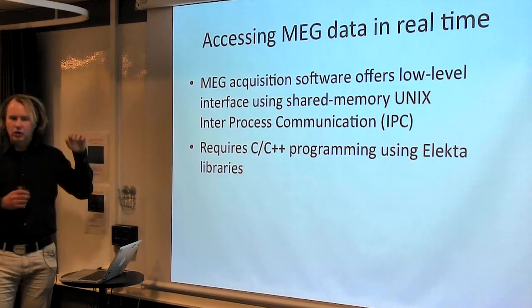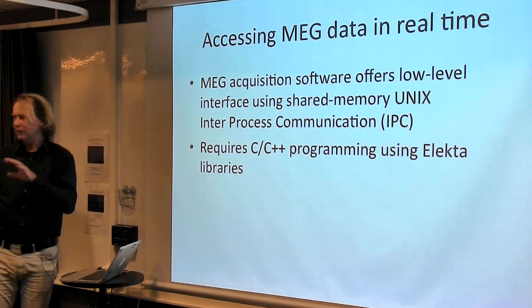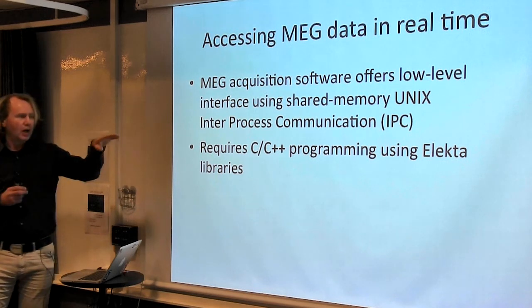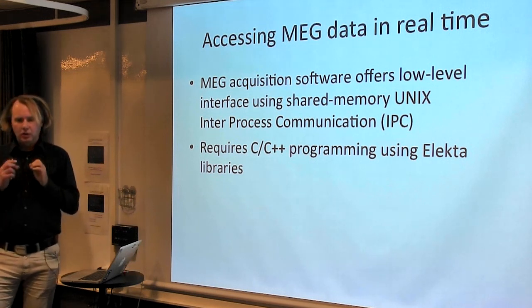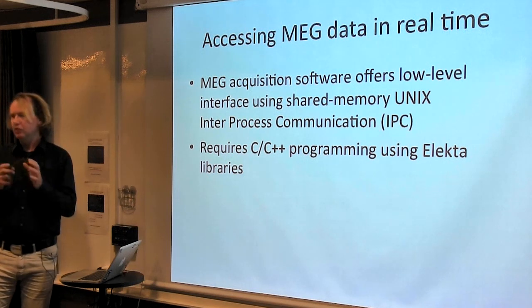That means that if you're a C programmer and you know how inter-process communication works, you can access the data. But it does require C or C++ programming skills, and you really have to dig into these Elekta programming libraries. That's okay if you have an engineering background or an engineer that can help you with this, but it's not very efficient.